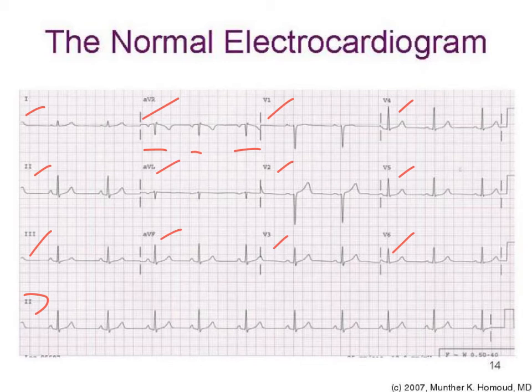When you look at an ECG tracing, you'll see these little marks. Each little mark is the start of time, and the ECG is recorded in all the 12 leads starting at the same time, which is this click mark, and for a certain number of seconds. And here you can see that we have been able to capture 3 beats, 1, 2, 3 in this block, and depending on how fast your patient's heart rate is, you might be able to capture 4 beats, or you might only be able to capture 2 beats, and we'll go over that a little bit later.